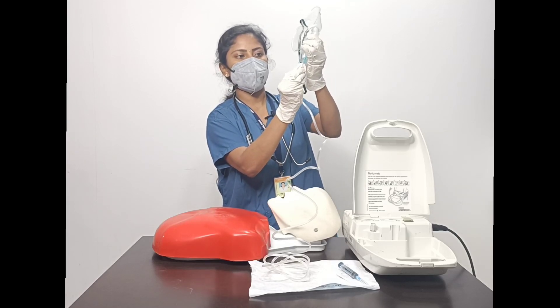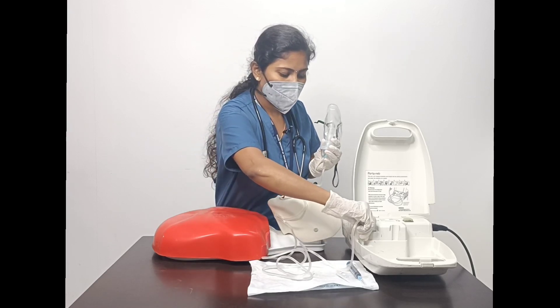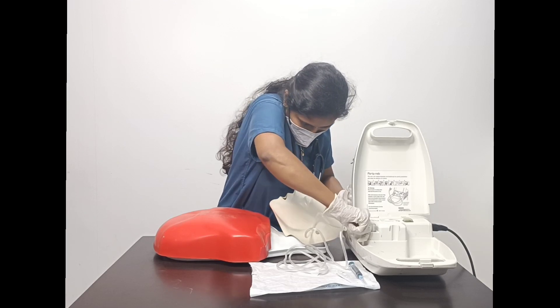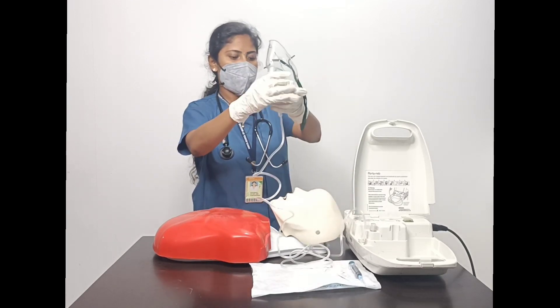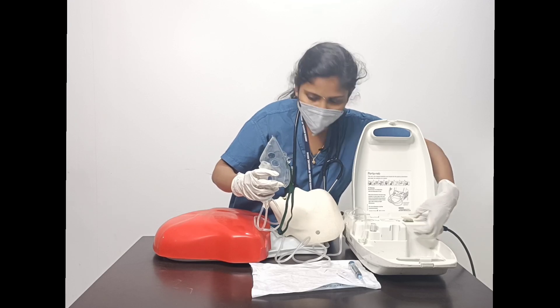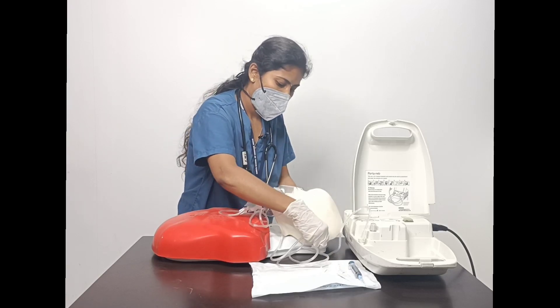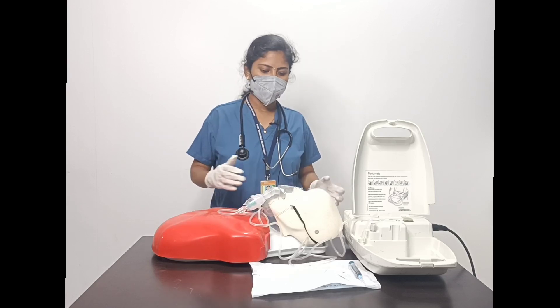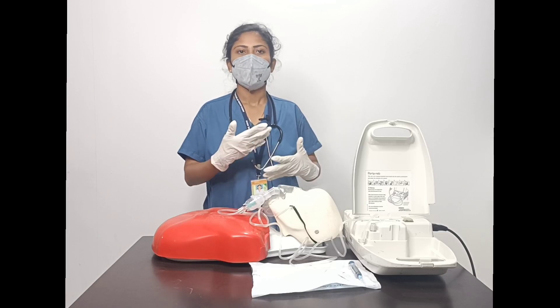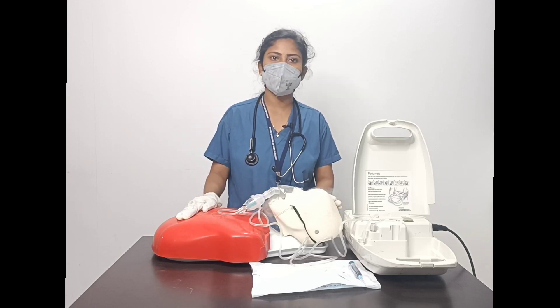Connect the nebulization tube from the end of the nebulization chamber to the machine. Then switch on the machine. Connect the mask to the patient and confirm that mist is being produced. Check that the patient is comfortable with the nebulization.